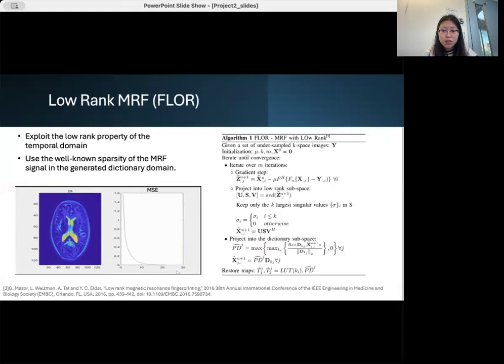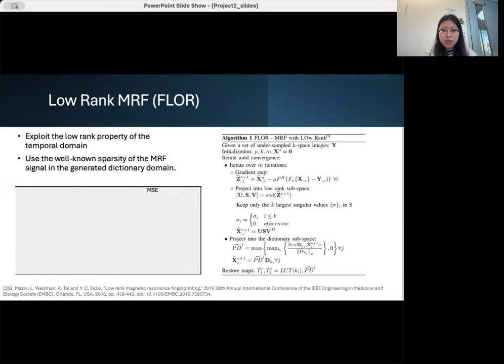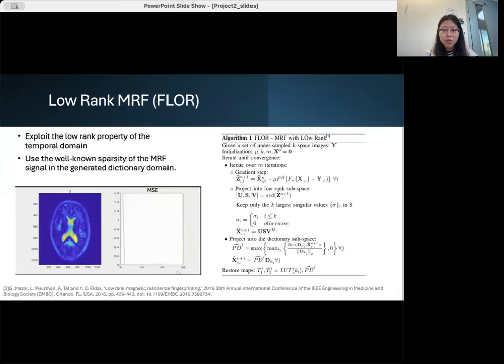The algorithm is shown here. Firstly, initialize the parameters. X is the signals processed after the Bloch equation, and Y is an undersampled Fourier transform of the image frames. Then repeat M times. Each time, enforce data consistency with the measured k-space-based samples through gradient descent at first, and then do the low-rank projection and update X. The aim is to make the reconstruction better.